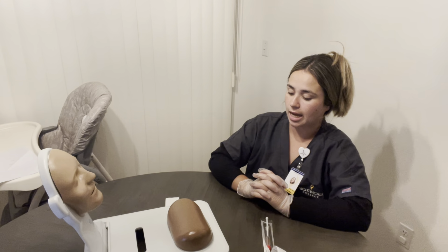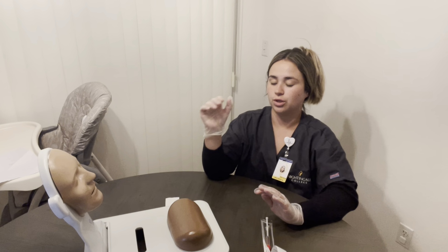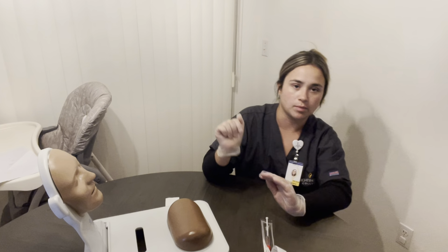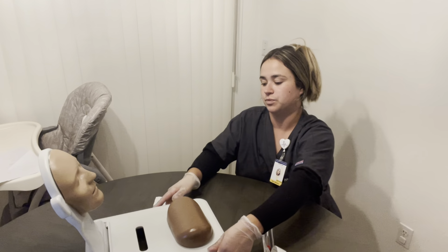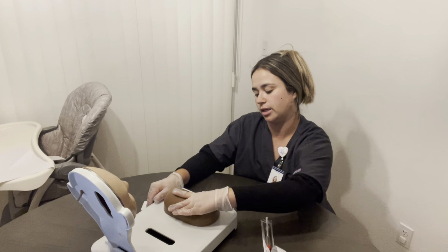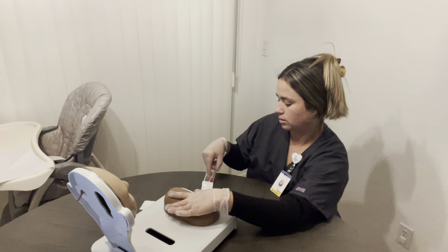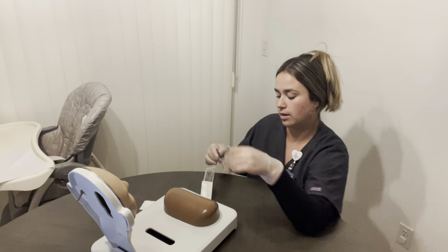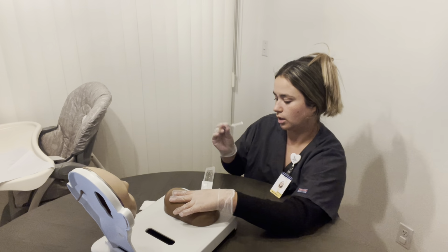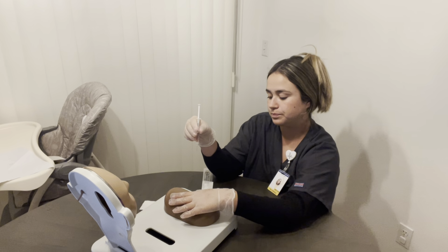So next I would go ahead and place, okay. So I accidentally did it, I was showing you guys with my dominant hand, but it would be with my non-dominant hand. So I'm just going to go ahead and rotate. And I know where it needs to go, so I'm just going to place my hands right there, okay? So I'm going to take off the cap. Now we're going to go ahead and inject at a 90-degree angle, okay?